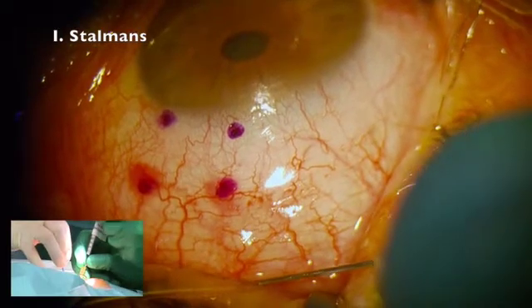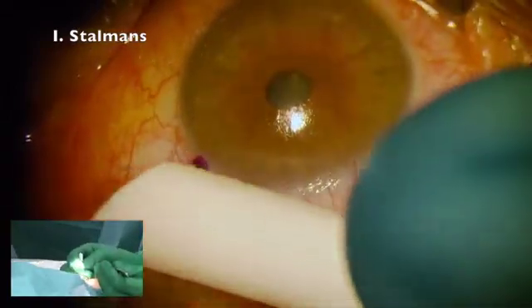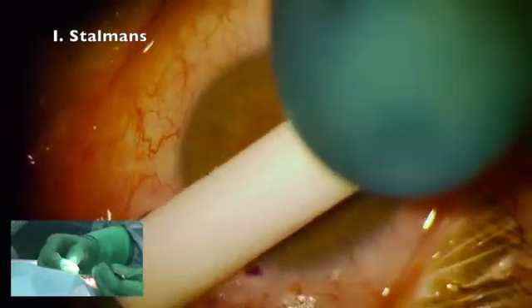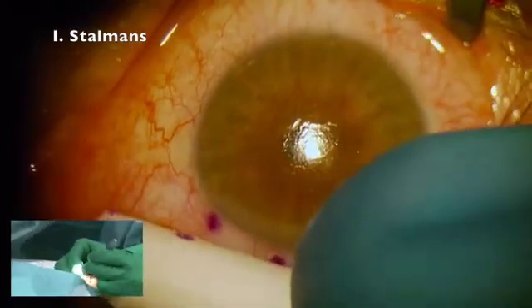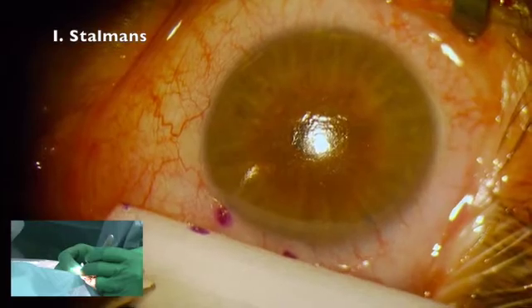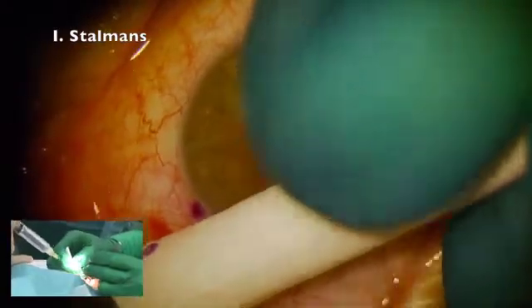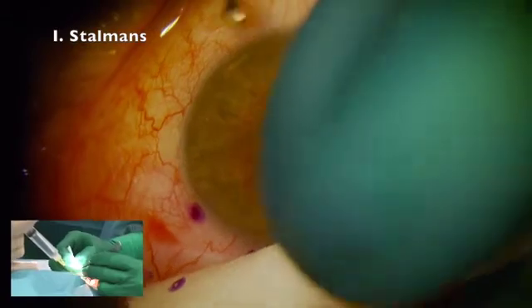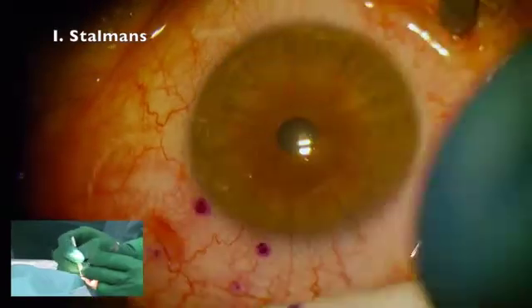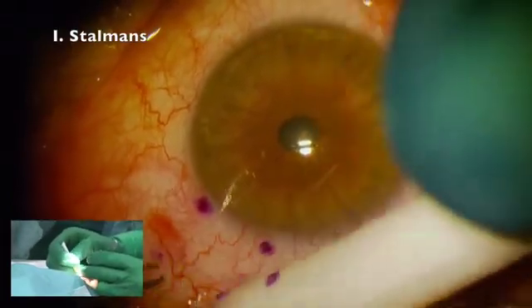As you can see, I'm injecting far in the back and superficially, because I like to place the implant also quite superficially. I basically want to elevate the conjunctiva and place the implant just below the conjunctiva. I don't want to have mitomycin right at the limbus because that's where it can cause problems. I like to keep it in the back and just allow it to come forward to lift the conjunctiva slightly, exactly where I'm going to aim with the implant.